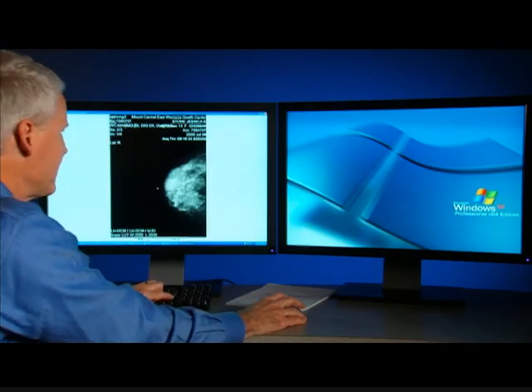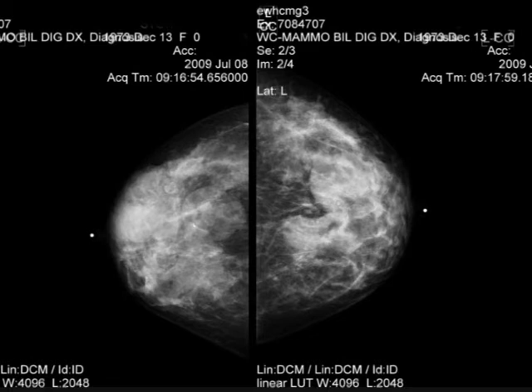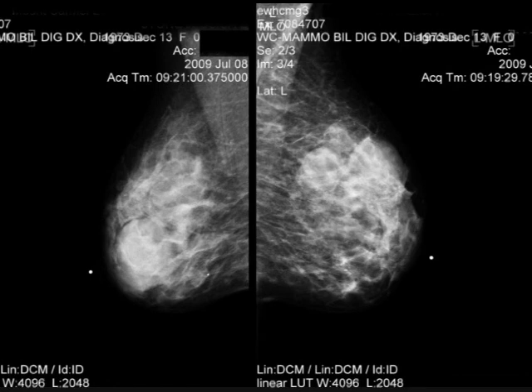Our next patient will be continuing pretty much in the theme of high-risk screening. This was a 35-year-old female who had a history of premenopausal breast cancer in her mother. She had begun mammography 10 years earlier than the diagnosis of her breast cancer, but had recently, about 2 years ago, started high-risk screening with breast MRI as well. Her mammograms show heterogeneously dense tissue with multiple masses bilaterally. There are some scattered benign calcifications, but no malignant appearing calcifications are apparent.